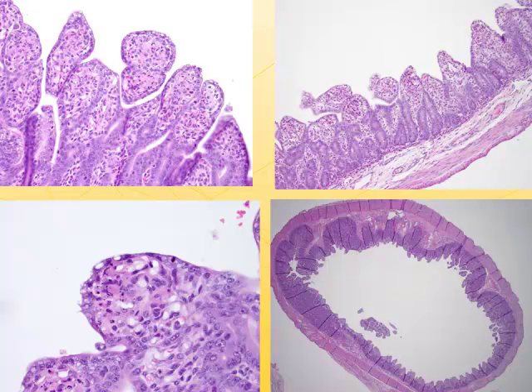Look at this other cross-section of the intestine. The lumen is pretty much empty. In a normal pig, we would have all these villi projecting inside of the lumen, and here it's pretty much lost. It's very, very thin. So even with these gross lesions, let me go back to the comment on thin-walled intestines for gross lesions. Even with this type of severe microscopic lesions, I wasn't able to see this thin-walled intestine lesion grossly.